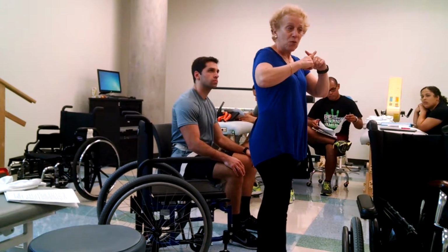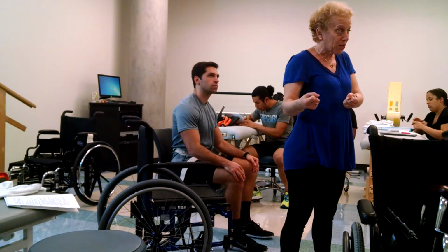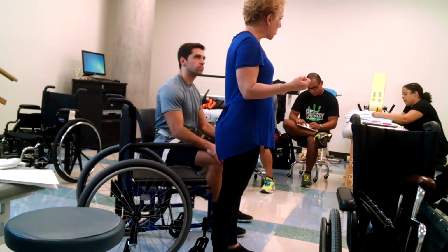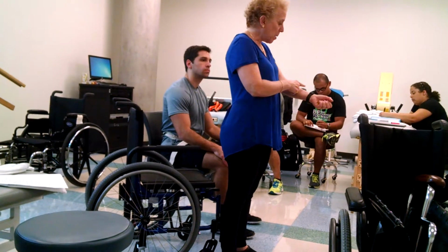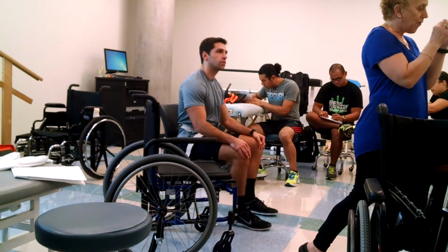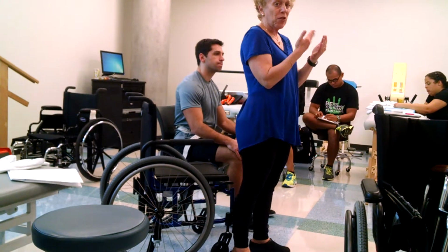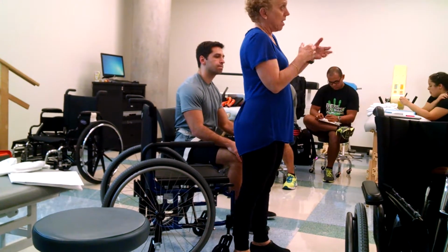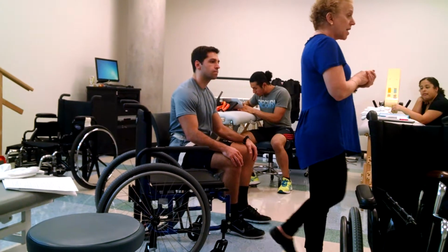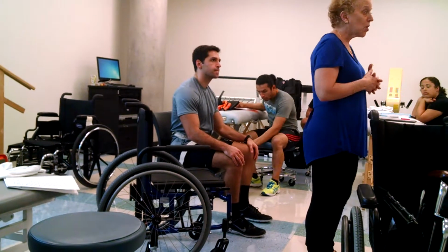And these are my reasons why you don't yank the patient up or lift the patient up by the gait belt. Have you ever heard of skin tears? Especially grandma. As people get older, they lose the cushioning layer of fat underneath the skin. And so that makes the skin a lot more fragile. Also, the skin is drier, so it's also more likely to tear. And a skin tear is often the beginning of a pressure sore. Okay, so we don't want that to happen.